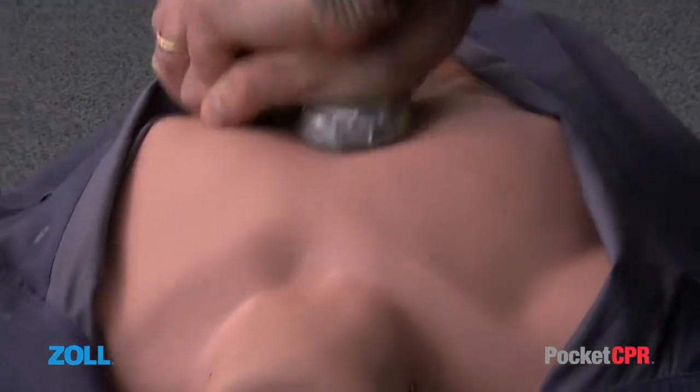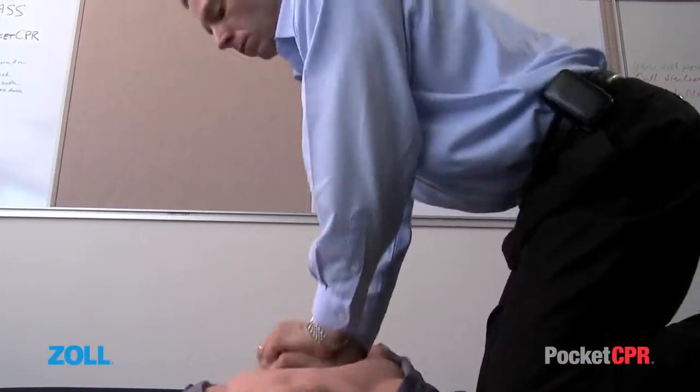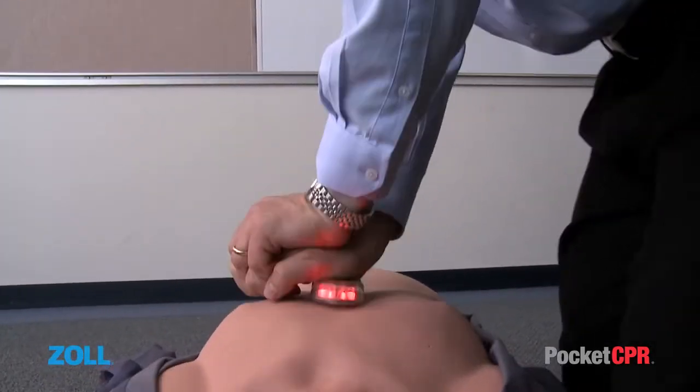Your hands are acting as a substitute for the patient's heart, pumping blood to the brain and heart itself. After each chest compression, the rescuer should release pressure quickly and completely. This release ensures that blood flows back into the patient's heart.